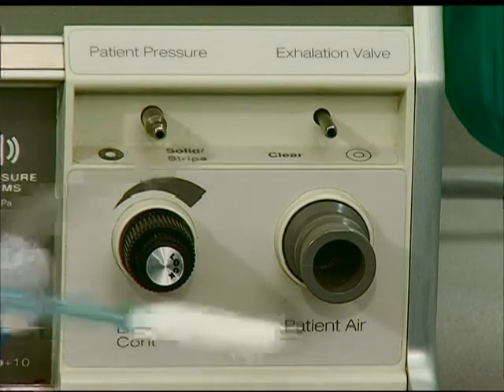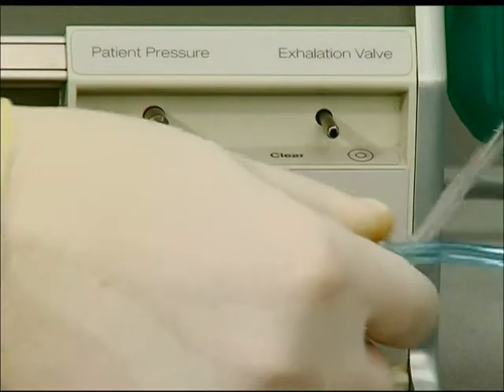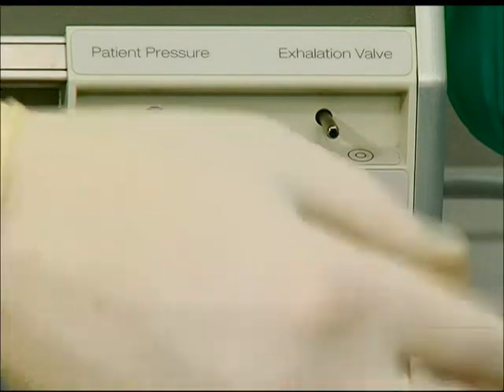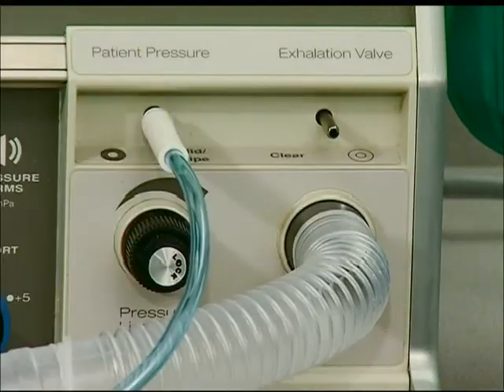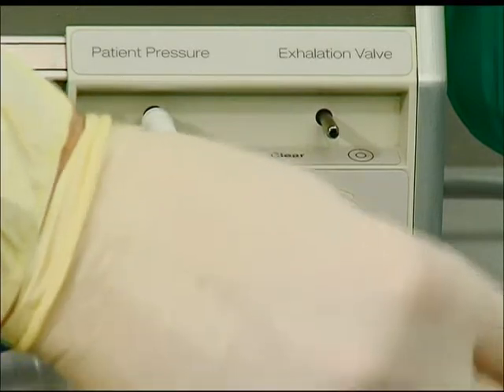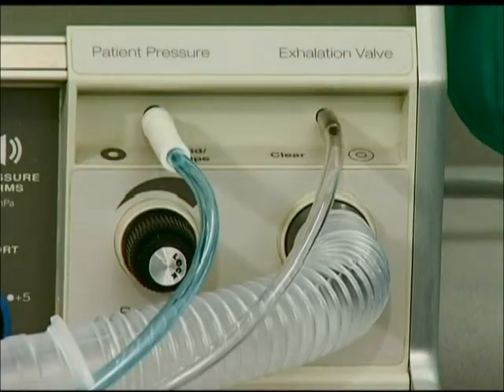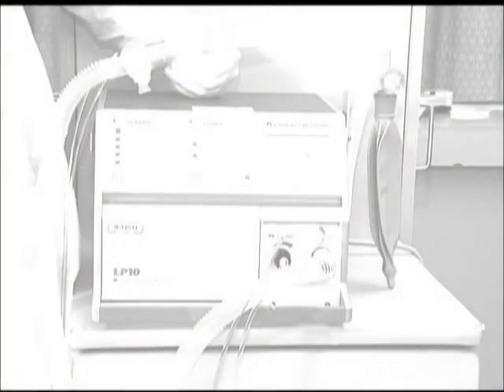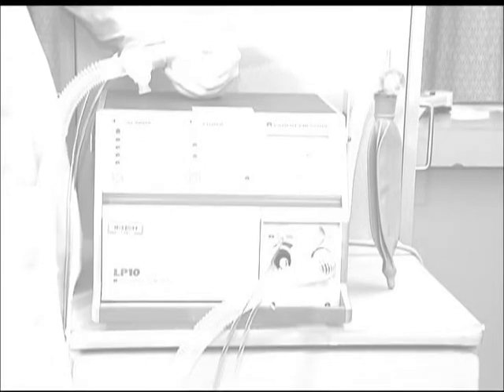To connect these fittings: connect the 22-millimeter corrugated hose to the ventilator patient air fitting; connect the green transducer hose to the ventilator patient pressure hose fitting; connect the clear exhalation valve hose to the ventilator exhalation valve hose fitting. Once assembly has been completed, the unit should be evaluated for proper function before being connected to a patient.